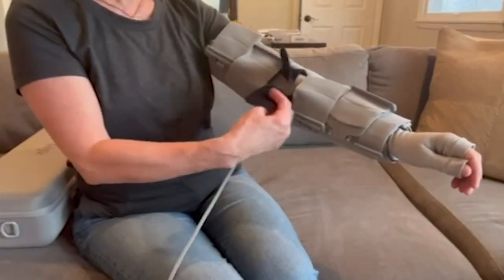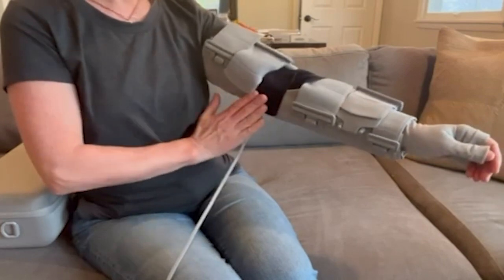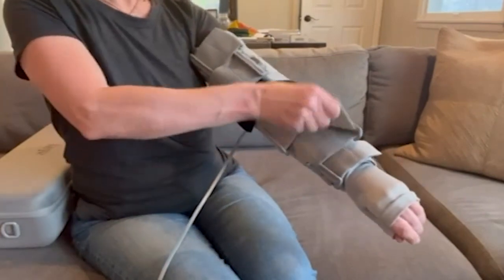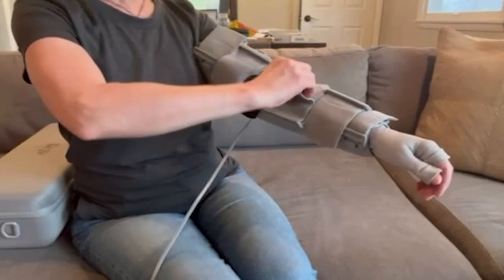Fasten each of the black straps, ensuring that they aren't crossing each other. Adjust each of the other straps by pulling it side to side to tighten and ensure a snug but comfortable fit. Make sure there are no gaps between the liner and the garment.